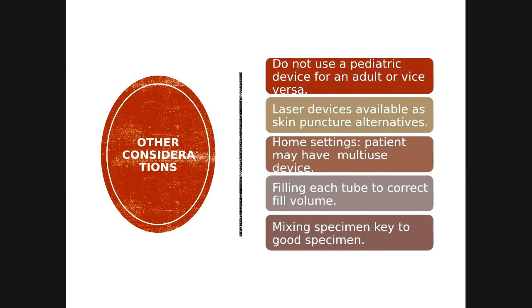Laser devices are available as skin puncture alternatives. In the home settings, patients may have a multi-use device, which is appropriate for them, but we cannot use that device in a lab setting. We're going to fill each tube to the correct fill volume, and mixing the specimen is key for a good specimen. Again, we invert it 10 times.